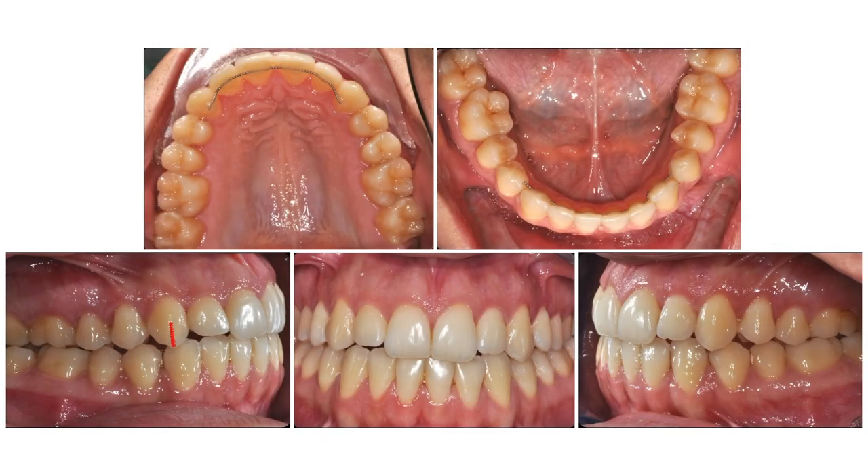These are the final photographs. We have a slight second class on the right and a slight third class on the left of the patient. This, of course, will shift the upper midline to the left and the lower midline to the right, but as the song goes — you can't always get what you want, but sometimes you get what you need — which is patient satisfaction.